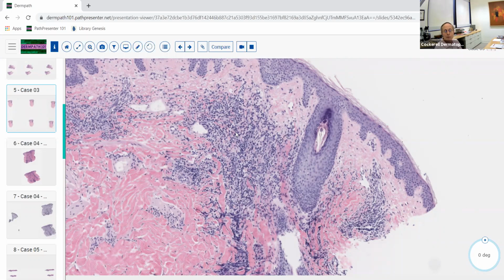pattern with plasma cells. So if you see a lymphocytic infiltrate with no plasma cells, think more of erythema annulare centrifugum and one of the gyrate erythemas. If you see some plasma cells in there, think about the possibility of this. And then, of course, you might even throw in there the theoretical possibility, especially if it's a more nodular infiltrate, of, say, a marginal zone lymphoma, which has lymphocytes and also plasma cells in the infiltrate. So that's EAC. Lyme ECM.